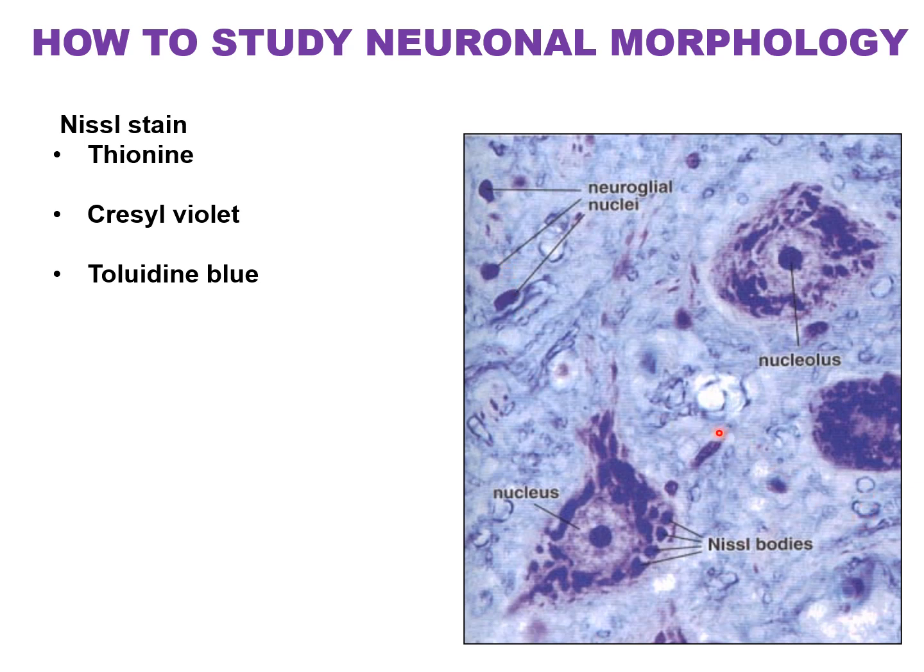In some of the places you can see the capillaries lined by the endothelial cells. The nucleus of the endothelial cells takes the Nissl stain also because they are basophilic stains.